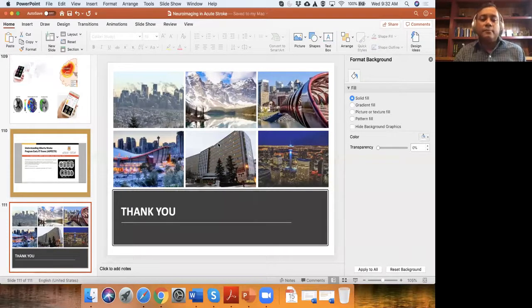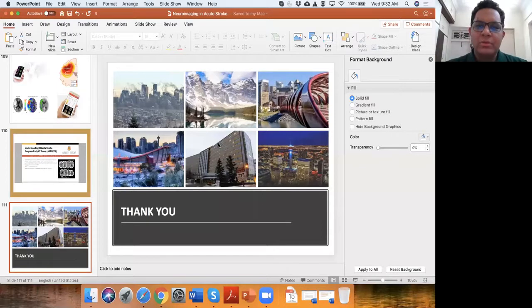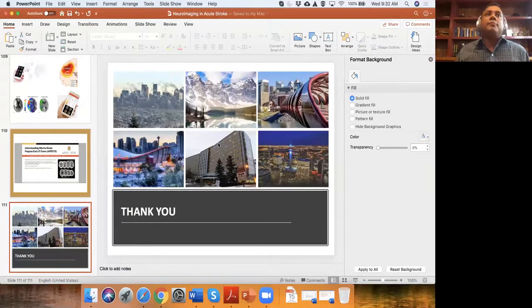Can we use ASPECTS score on MR diffusion? Yeah, there is a problem. Because of the high resolution with the MR, you may actually see more, you may overestimate ASPECTS extent, or underestimate. So imagine looking at the MR, right?